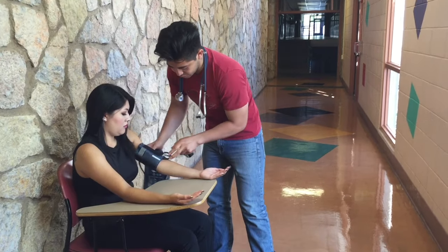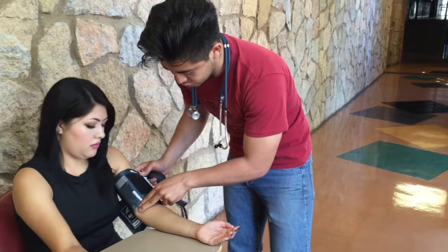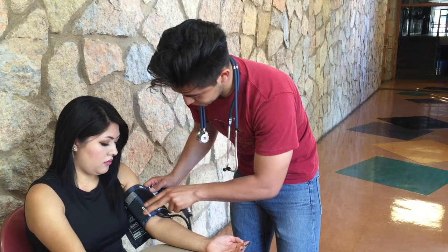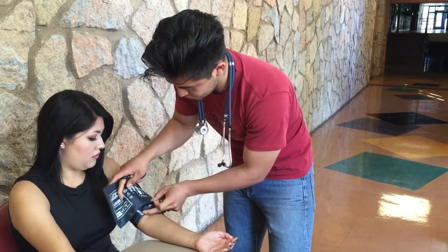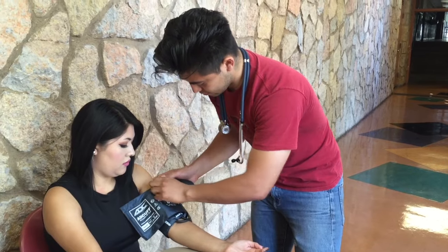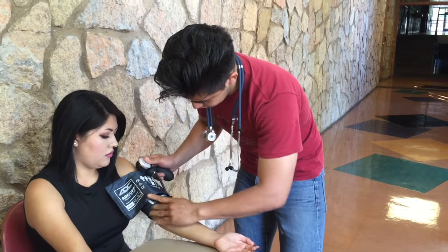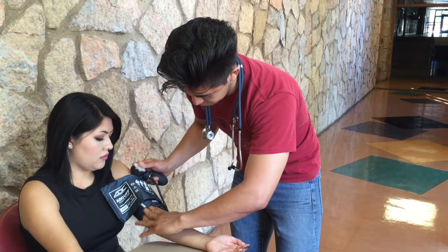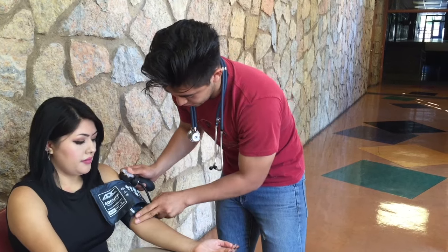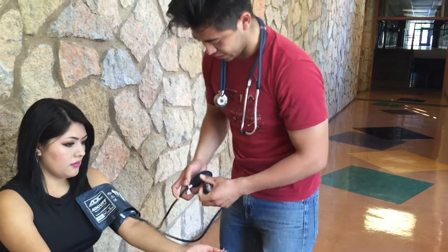When placing your cuff, you want to make sure that where you're going to place your artery mark is right where you feel for your brachial pulse. When placing the cuff, assure that you have a space of 2 fingers under the cuff and the space of 2 fingers above the crease.